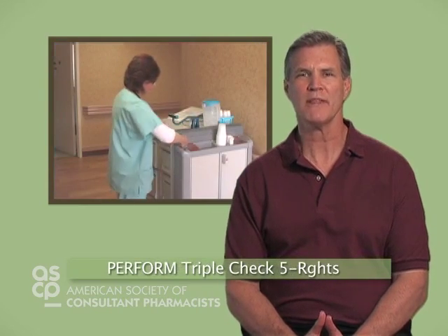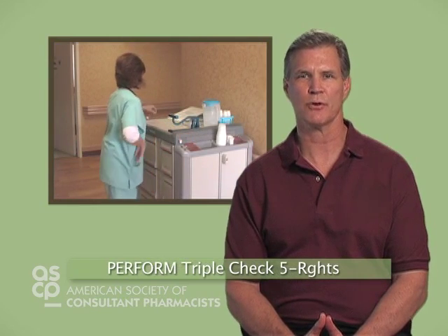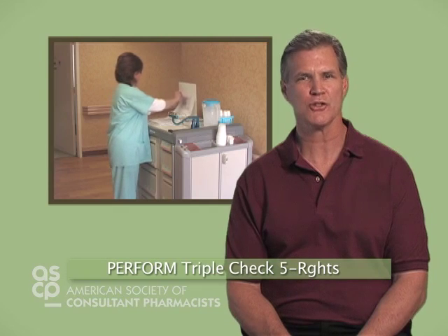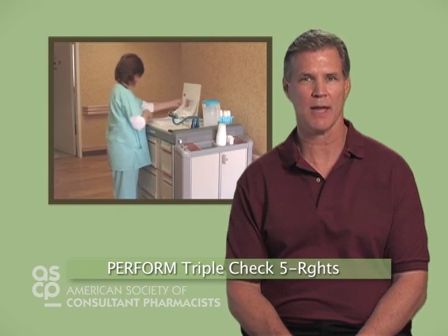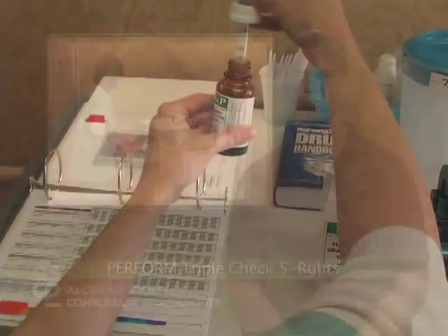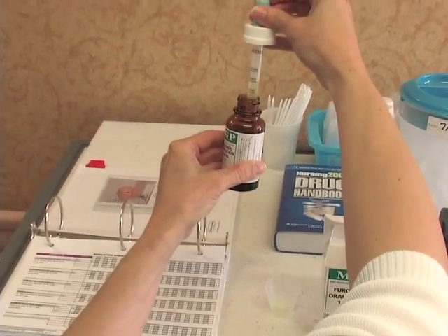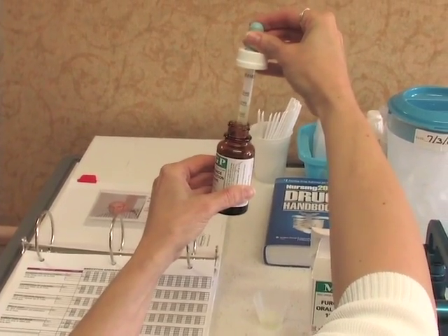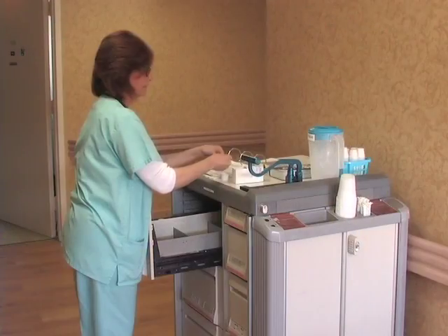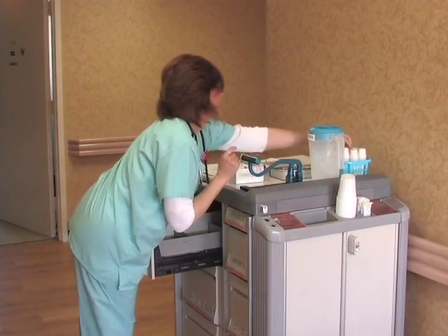Performing the 5 right triple check system for each medication prepared, our nurse ensures the right medication and dose is prepared at the right time for the right person, and the G-tube is the correct route. The small liquid dose of furosemide is measured by using a calibrated dropper, then placed in its own medication cup. Tablets are crushed into a fine powder.